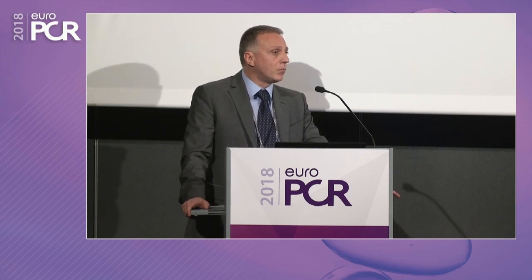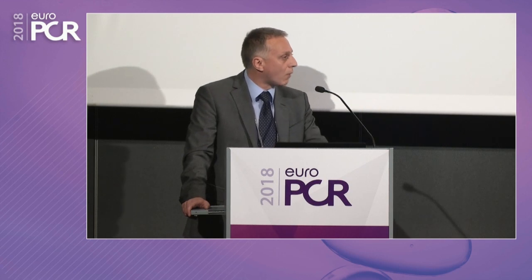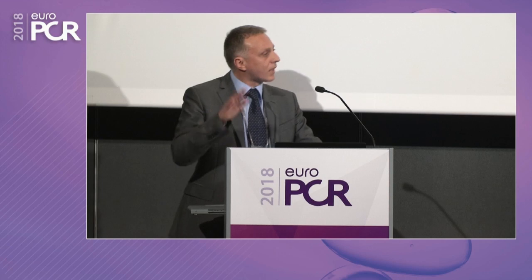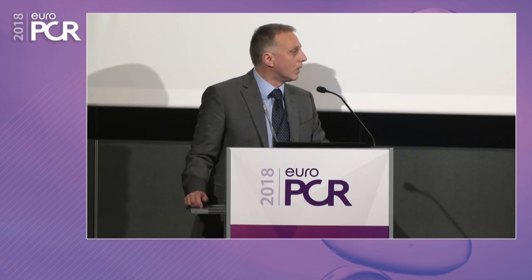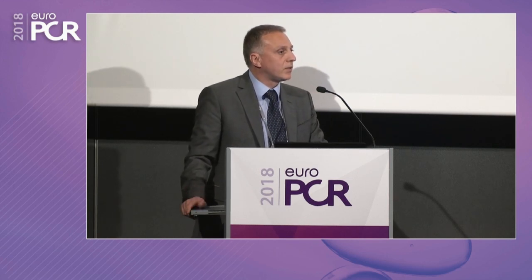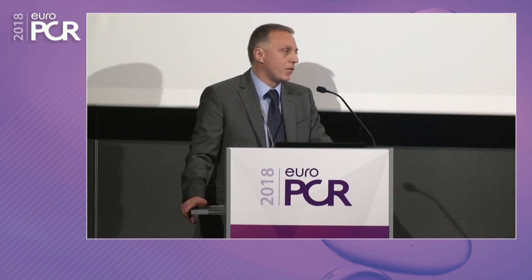Again, with the kissing, when you are going to rewire the second time, if you take some of the struts which are around, you may induce some uncoverage inside the side branch. So I think that culotte and DK crush are actually the most valuable clinical practice techniques, and they are complex. At the end, they may warrant fantastic results, but they may have pitfalls.